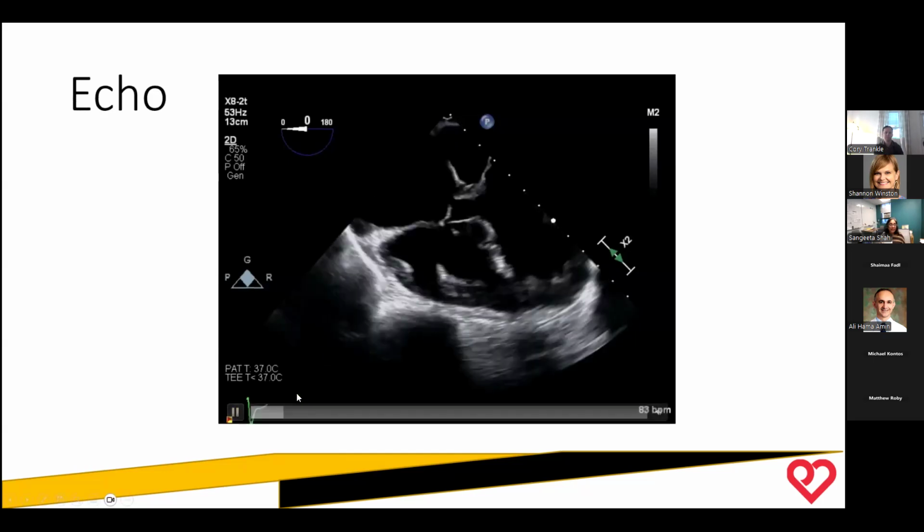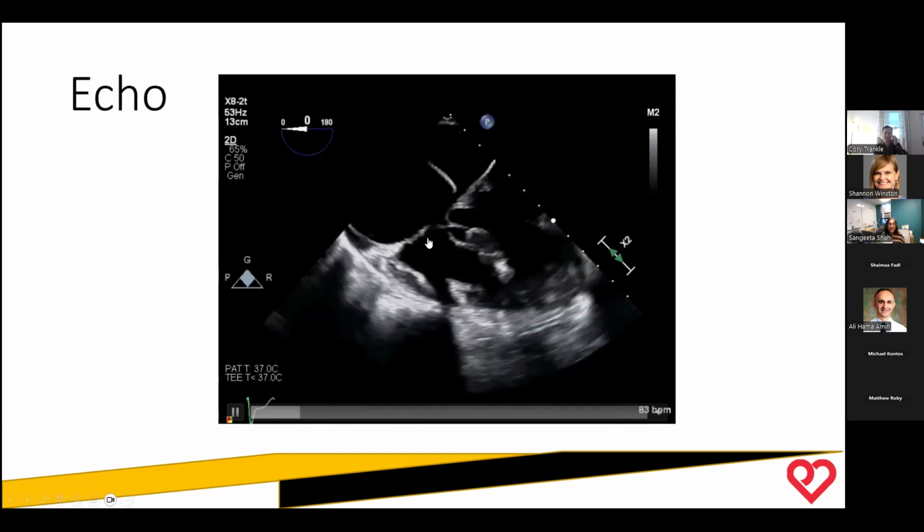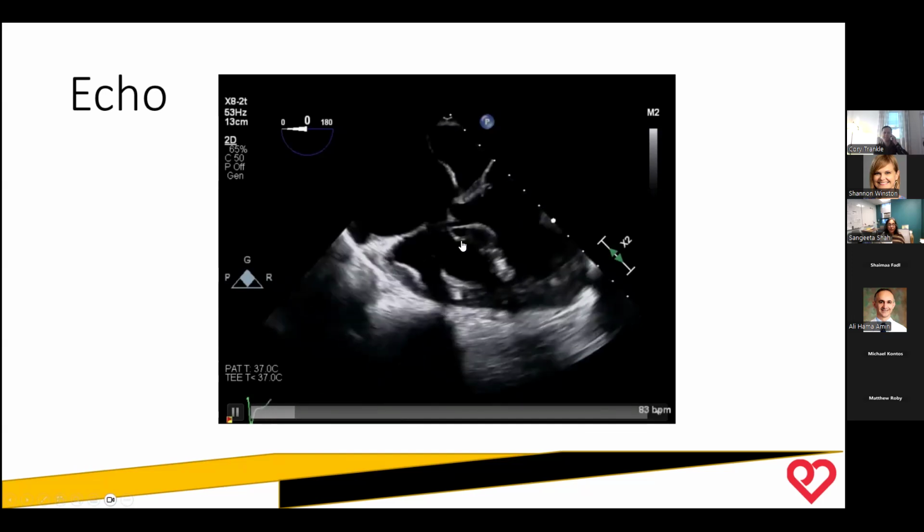I don't have a cardiac MRI image of this because we didn't need an MRI to send him to surgery, but I wanted to show you a couple of things. So we're going to look at his case, and this is a primum ASD, and I'm just going to highlight the beautiful ASD here. The other thing I'm going to highlight is the AV valves coming at that same level. And if you see, some of the tricuspid valve tissue is attached here to the ventricular septum.